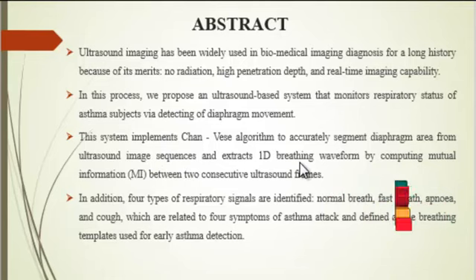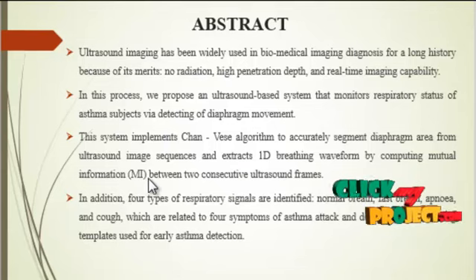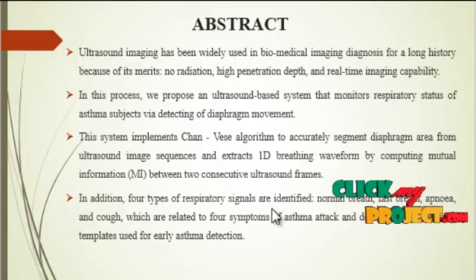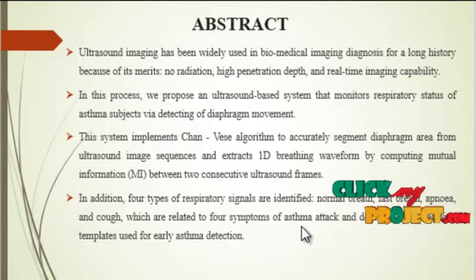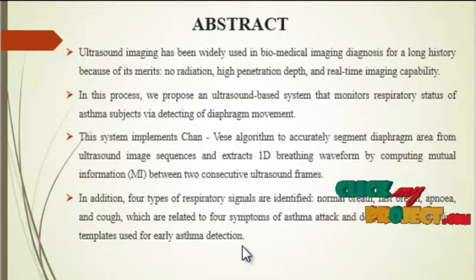and extracts the 1D breathing waveform by computing the mutual information between two consecutive ultrasound frames. In addition, 4 types of respiratory signals are identified, which are related to 4 symptoms of asthma attack, and the breathing templates are identified for early asthma detection.